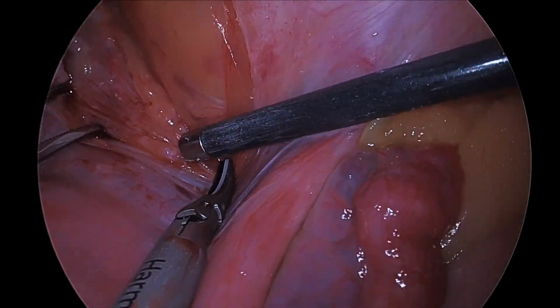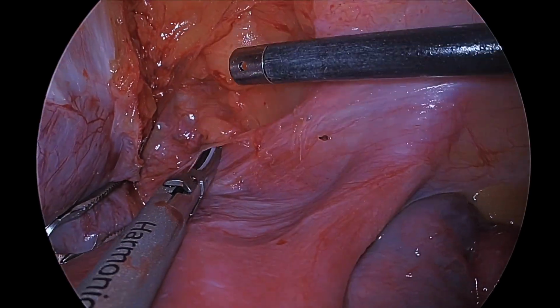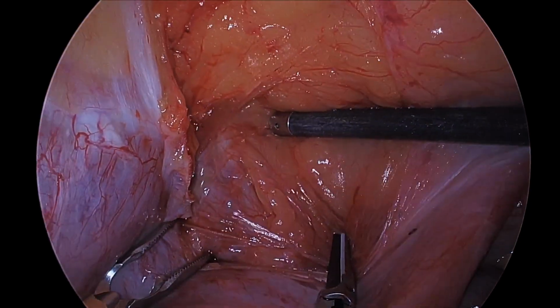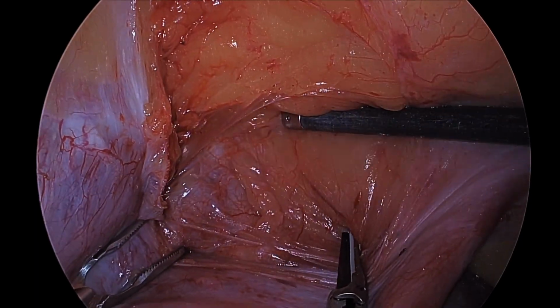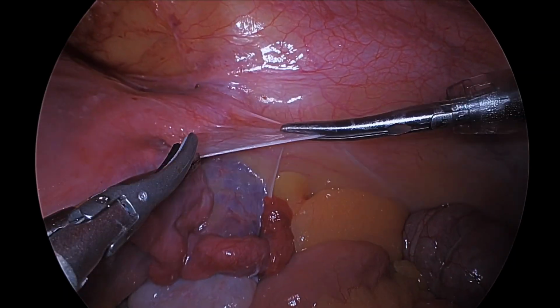Due to the patient's BMI of 35 with a central distribution and significant vascularity as expected in a 9-week gravid uterus, the anterior approach was abandoned. However, the internal iliac artery was identified with a tortuous branch of the uterine artery. A lateral approach was then undertaken.